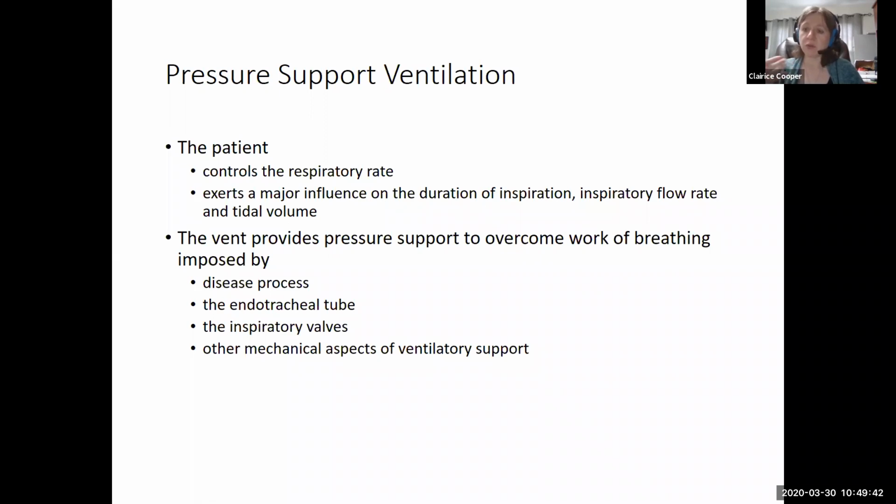If you think about breathing through a straw as you do an activity, that increased resistance, Poiseuille's law, where resistance is proportional to the length and inversely proportional by a factor of 4, an exponent of 4, to the radius. The patient is breathing through a thinner tube than they're used to over a much longer distance. And so the pressure support, once we get down to a support of 5 to 7, is usually what is required simply to overcome the resistance in the circuit.